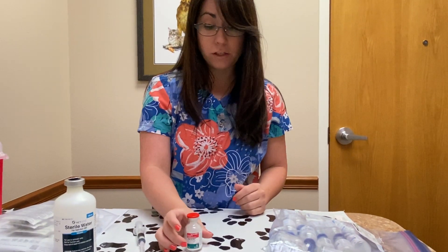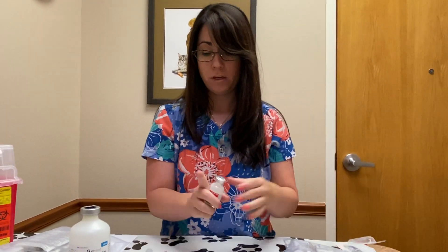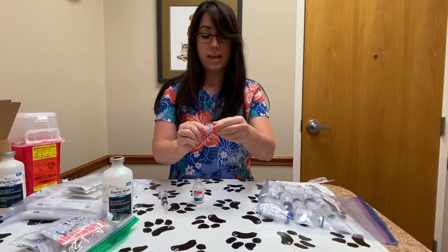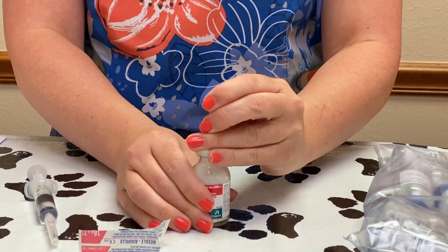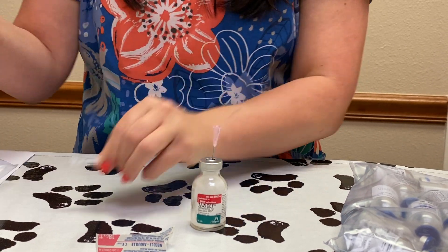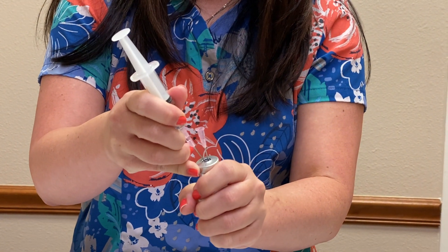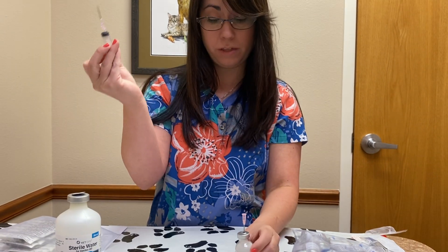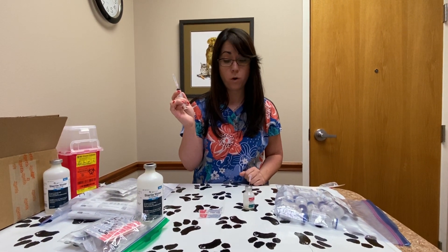When you're ready to actually reconstitute the mixture, pop off the lid — that can be disposed of in the trash. You will need a venting needle, so you're going to use two needles for this process. The reason is this is a pressure vial, so if you try to put your sterile water in without a venting needle it's going to be really hard to push down and will push back on you. Insert your venting needle, then put in your second needle with the three milliliters of water and push it down with even pressure. You can then reuse this — use your safe recapping method and hold on to it for the next time you need to mix up your Fortas.